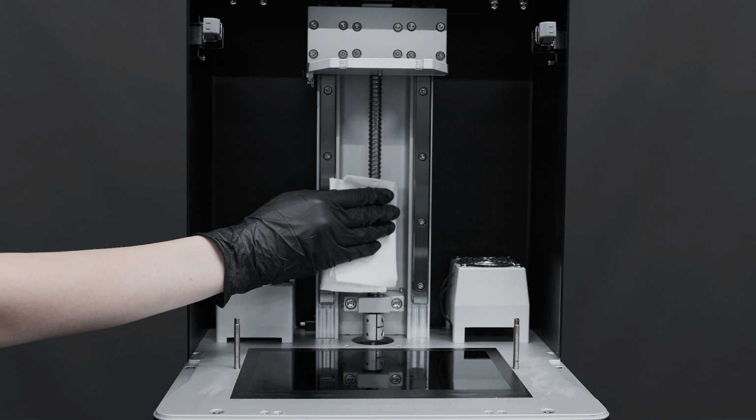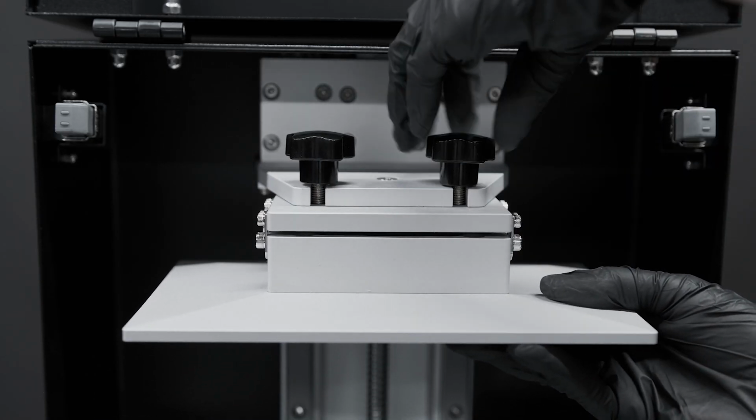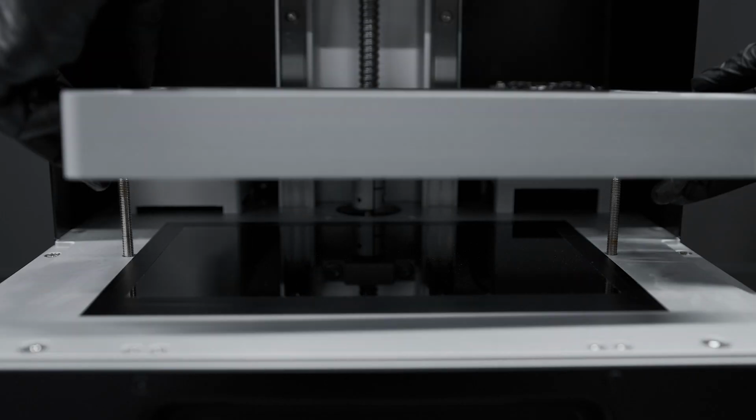Dry clean the axis using a paper towel. After finishing, fix the building plate and the resin vat back in place.